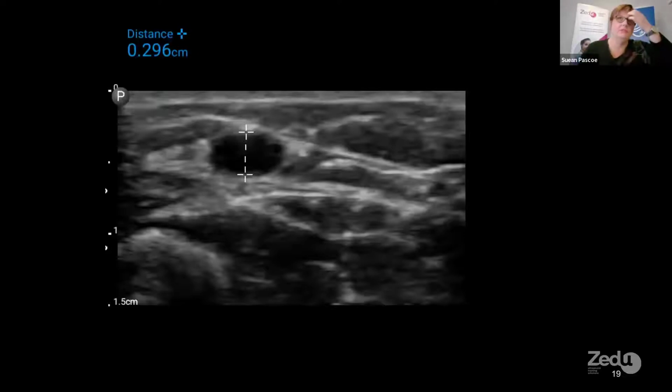Now the next step is to measure the size of your vessel. When you're choosing a cannula, the cannula or whatever tube you're putting in should only occupy about half the size of the vessel. And I think from memory, someone said a 3 millimeter vessel is a 3 French cannula. Anyway, you would understand the sizings better. But once you know how big the vessel is, you know what size cannula you can effectively fit in there. And you don't want the cannula to completely fill the vessel because that's going to pose problems for blocking it off. So you want the cannula to be about half the diameter of the vessel.